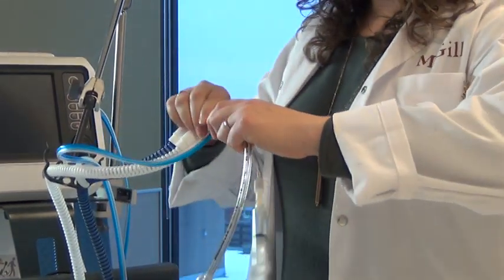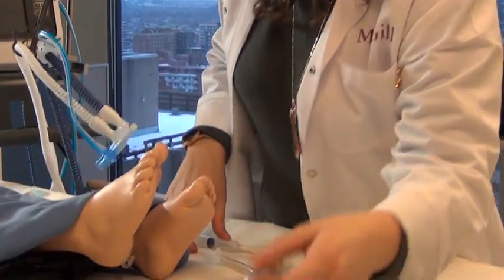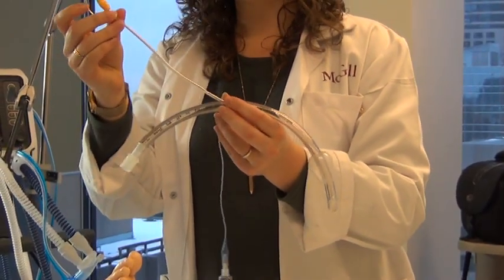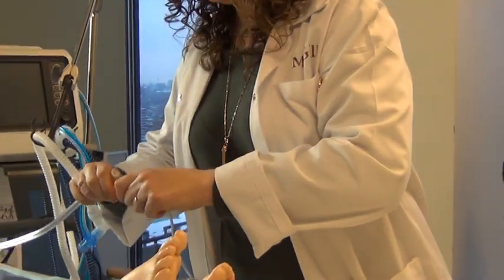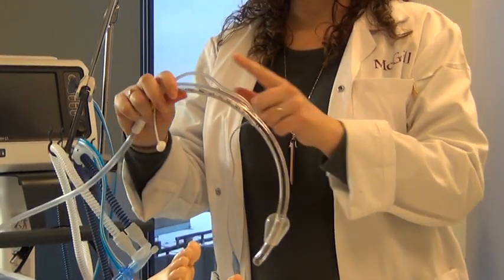Now, as I said, there could be different tubes, and an additional tube that we may see in practice has an additional lumen here that can actually be connected directly to a suction catheter that's connected to wall suction.